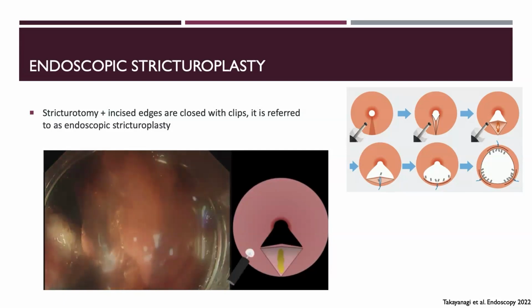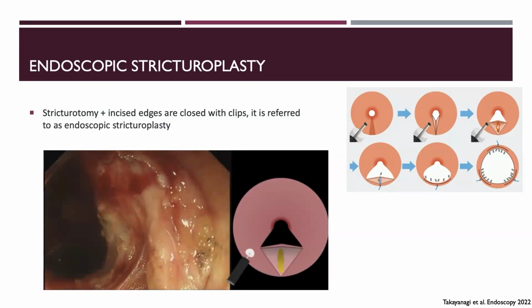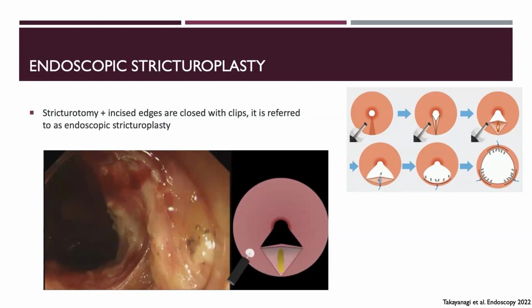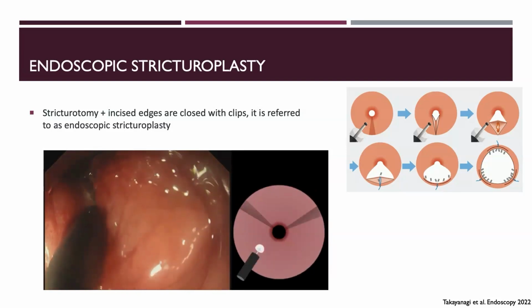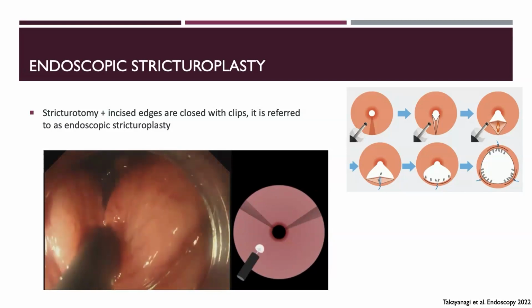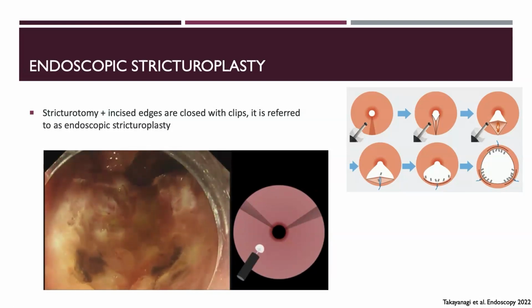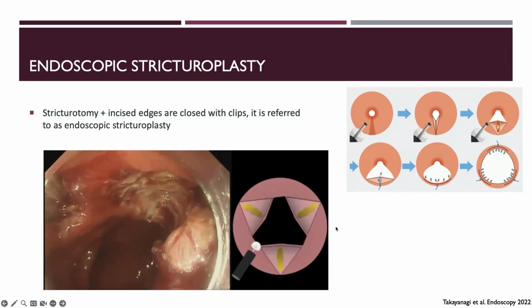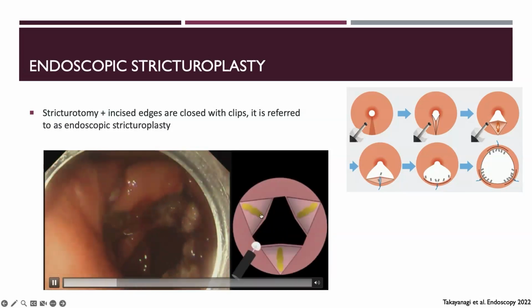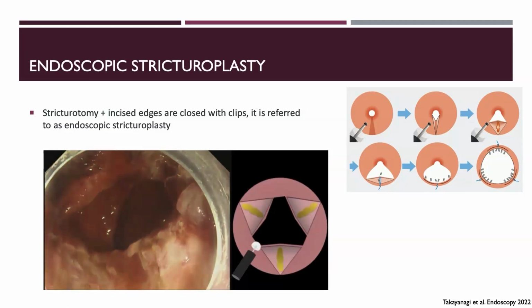Cutting of the stricture. So you can see here using a knife and cutting through until you really cut quite deep and cut into the circular and longitudinal muscles in a controlled way, where you're not seeing any sort of serosa or hopefully not into the peritoneum. So you can see deep cuts here, 3 deep cuts that have really widened it into a V-type structure.